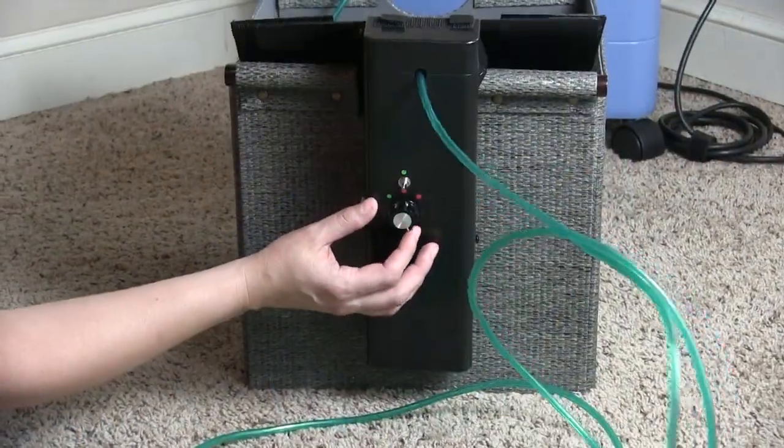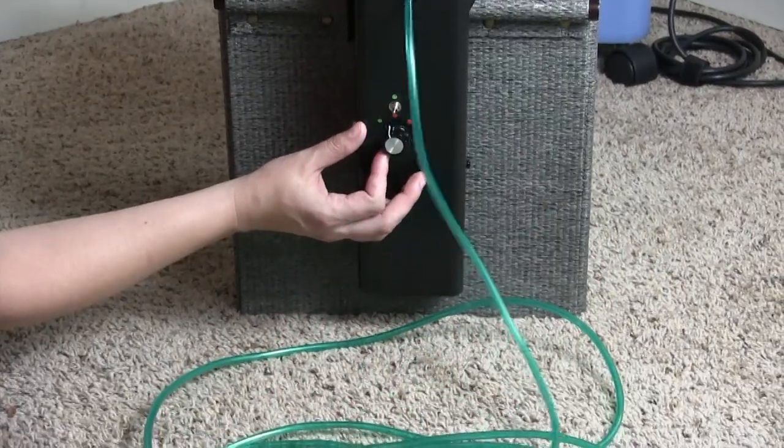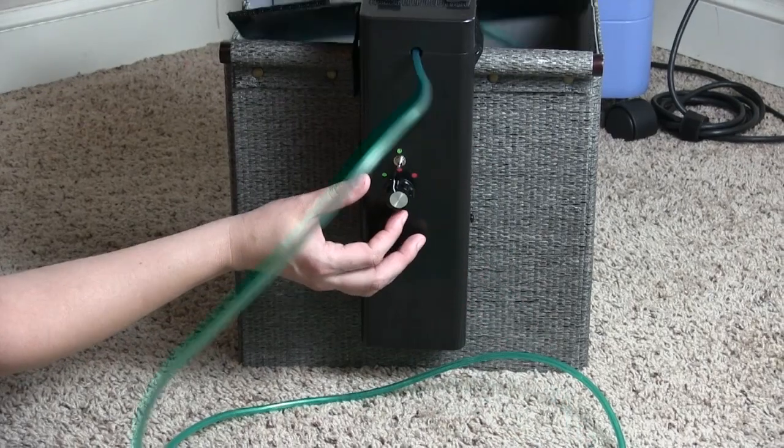With the OTCR, you control the speed — from very fast to very slow, or anywhere in between.